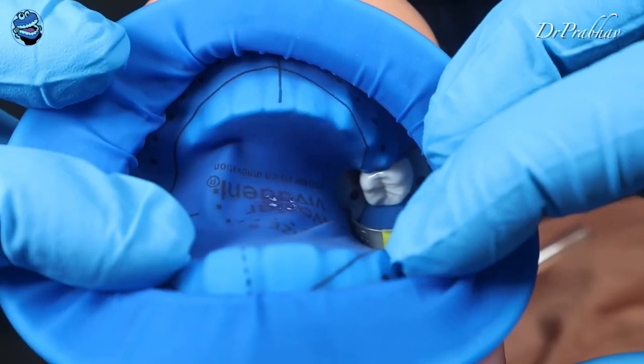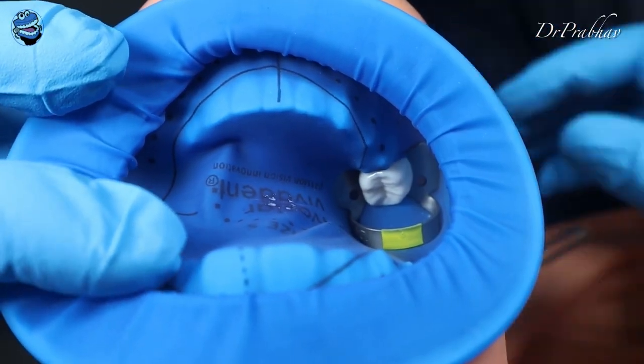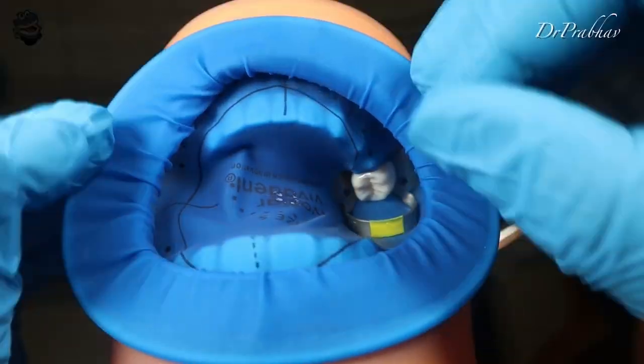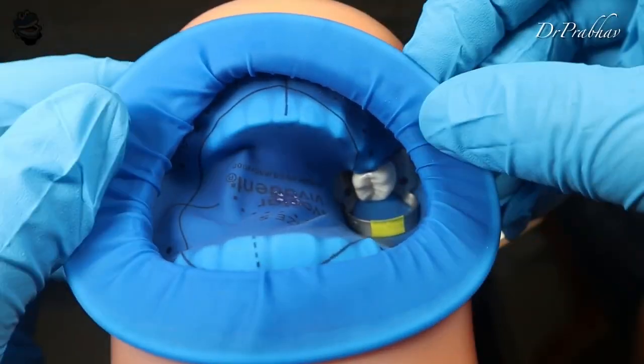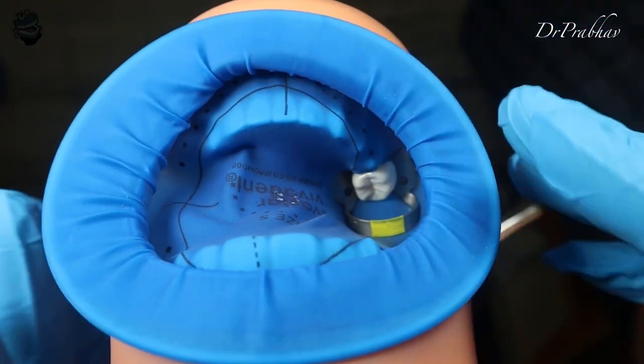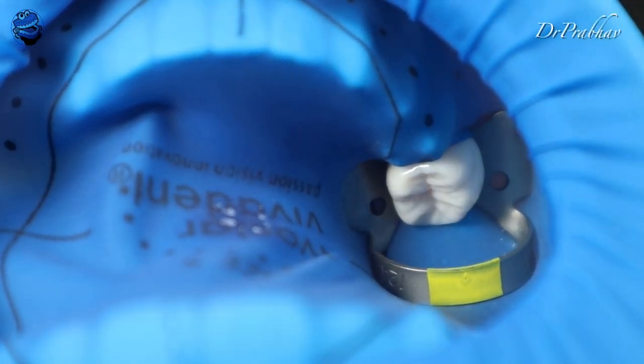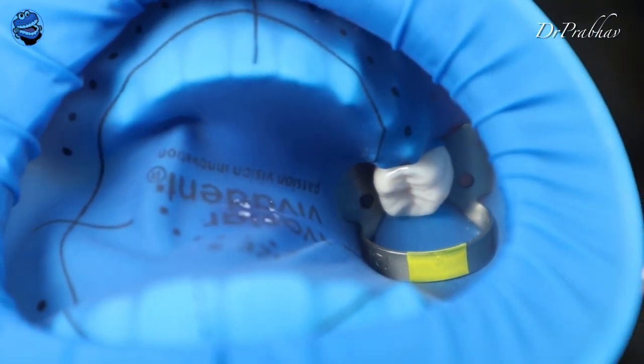Now our patient was happy and we could do the procedure. But we were worried about how we are able to disengage this rubber dam, or the OptraDam in fact, from the dummy patient, as he was happy. He was continuing after the procedure that he wants to be holding this in his mouth forever.